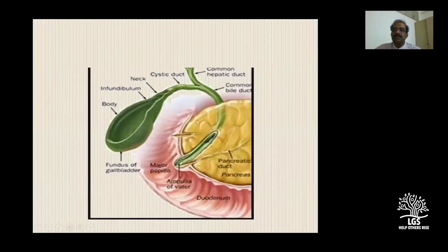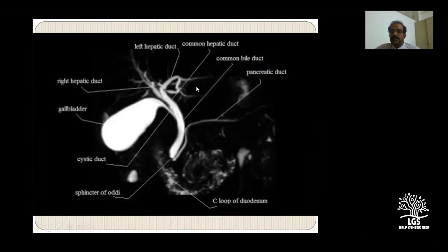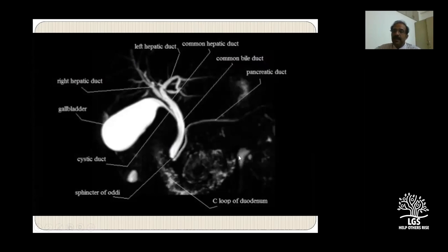This is a pictorial representation of how the biliary system looks. On the MRCP image - this is called an MIP image, maximum intensity projection - you have the gallbladder, the cystic duct draining into the common bile duct, the right and left hepatic ducts, and the first generation of biliary radicals. You see the pancreatic duct and the ampulla with the sphincter of Oddi. Any fluid-containing structure appears bright - fluid in the C-loop of the duodenum and in the stomach - which is why we restrict fluid intake before the scan.